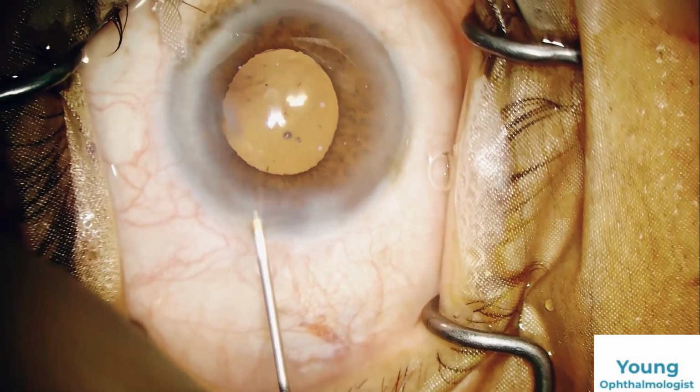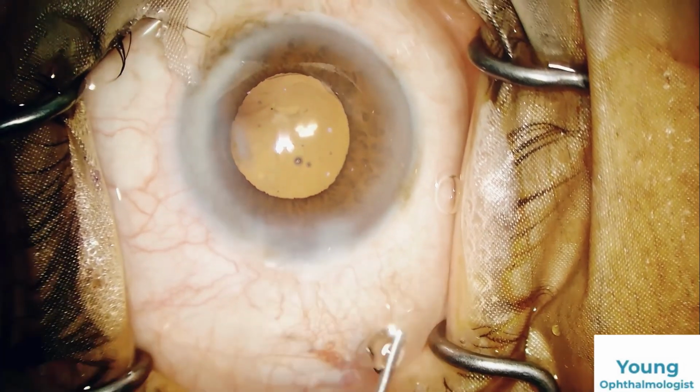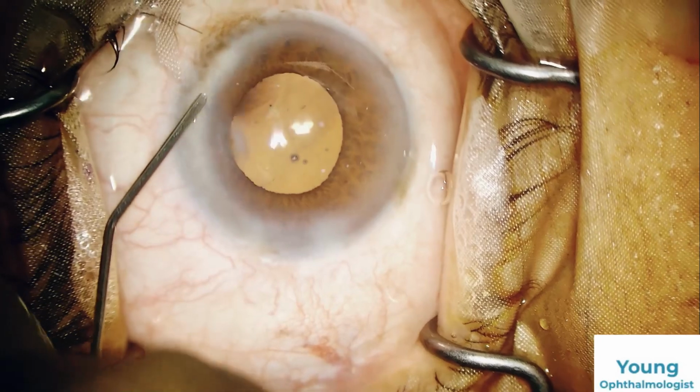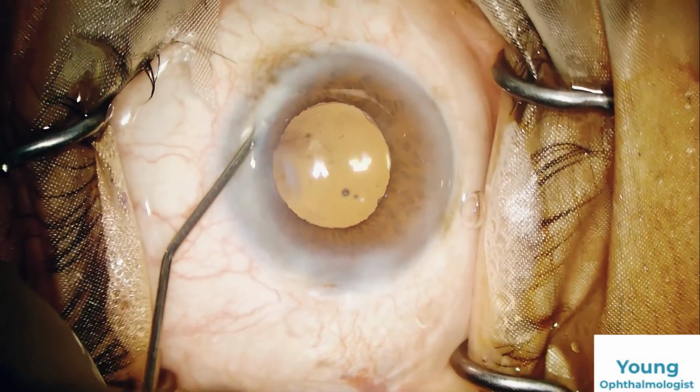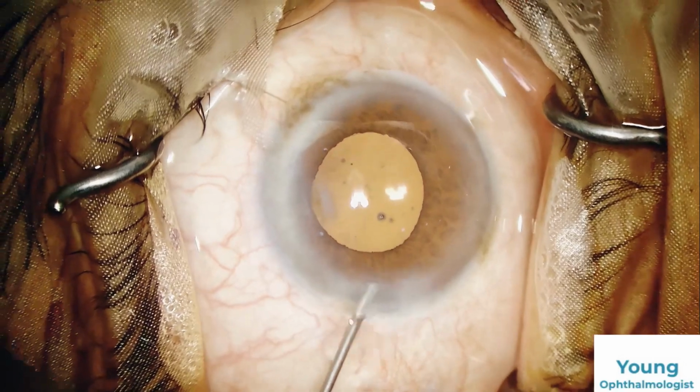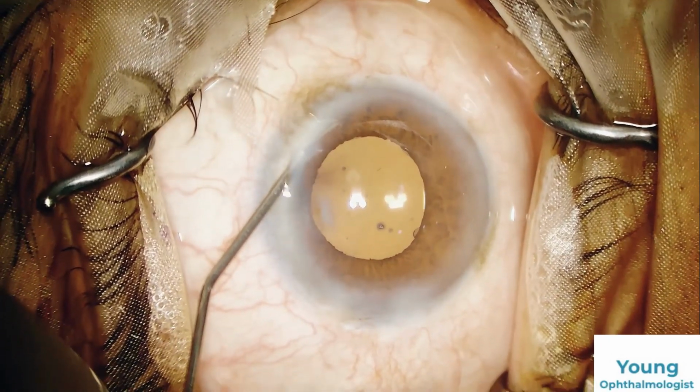Now hydrating the wounds. The main wound is hydrated. You should take care that DMD should not happen. Side port is hydrated. Here you can put a little more pressure and the case is completed.